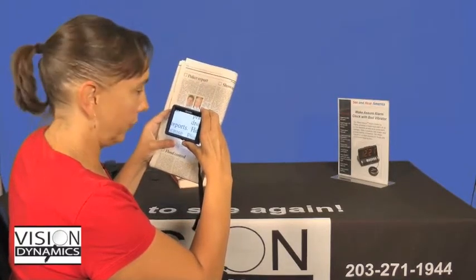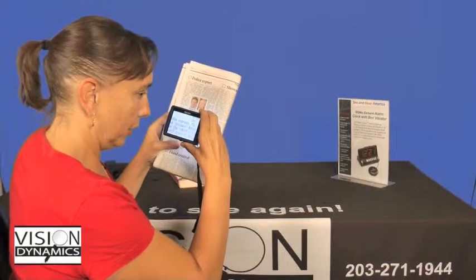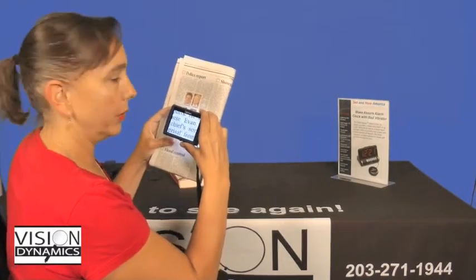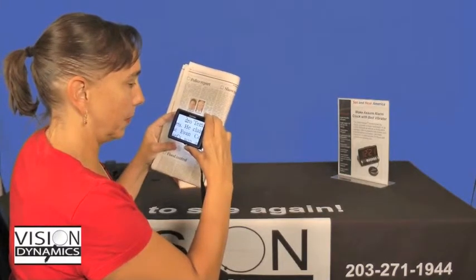And again, you can also change the size of the print by pulling it away a little bit or bringing it a little closer. So that'll give you even more range of magnification.